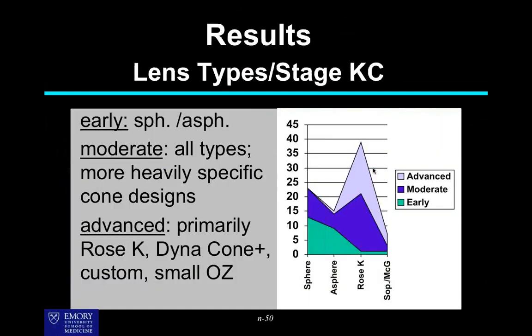So a number of years ago, I took 50 keratoconus patients and just looked at what are we fitting and how are we fitting in the way of corneal GP lenses.